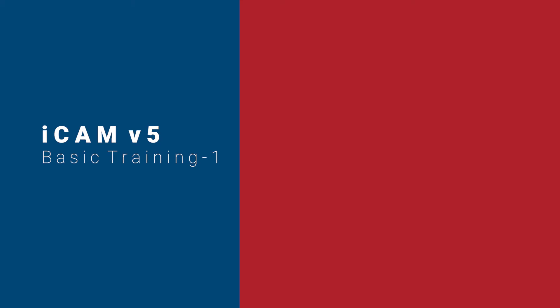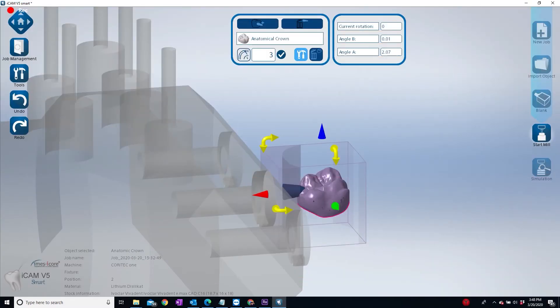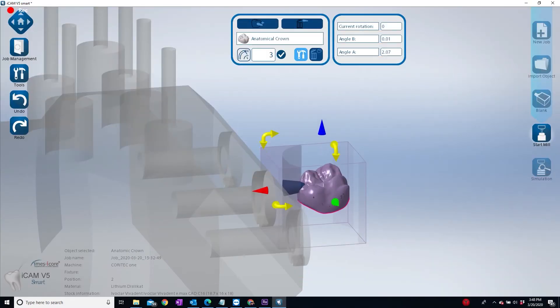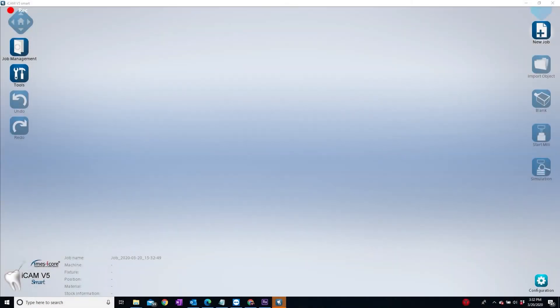In the digital dental workflow, the CAM software comes in immediately before actual milling. The workflow would go from scanning, which can be intraoral or desktop, to CAD, which can be done in any design software that generates an STL file, including 3Shape or ExoCAD.